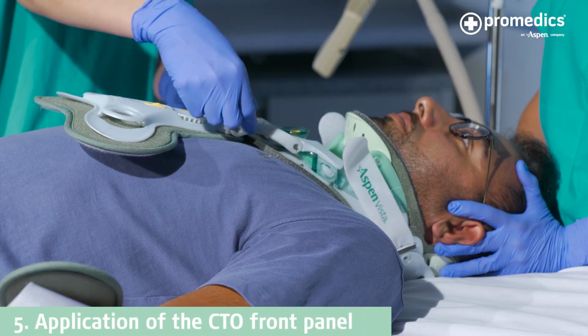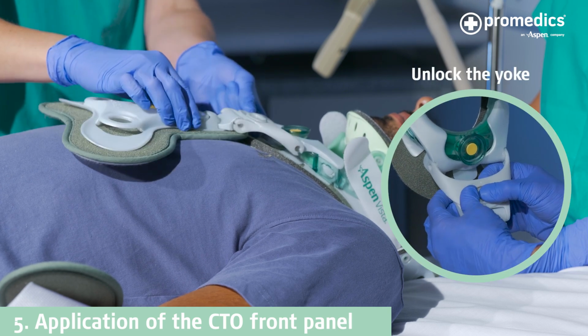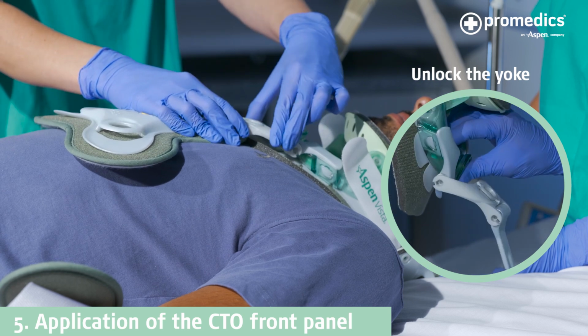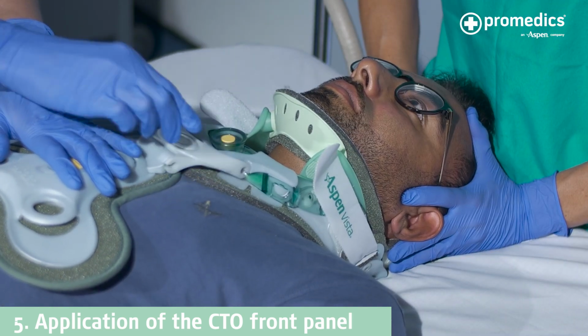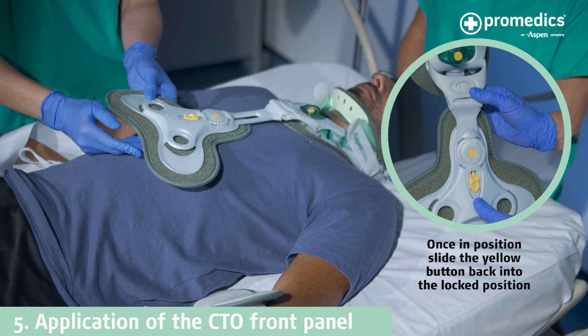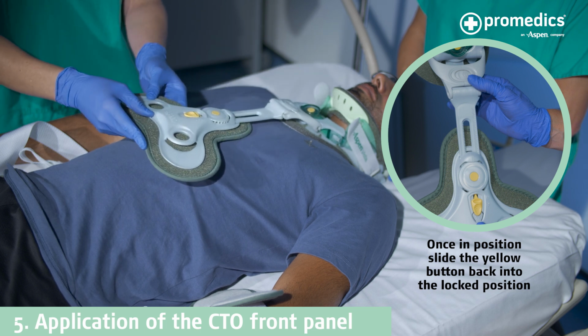The pitch of the front panel can be changed to suit the patient's anatomy. Push and spread the grey yoke button and allow this to drop onto the patient. Then click the yoke back together. The length of the front panel can be adjusted by pulling the yellow button down and then pulling on the lower section and positioning on the lower rib.